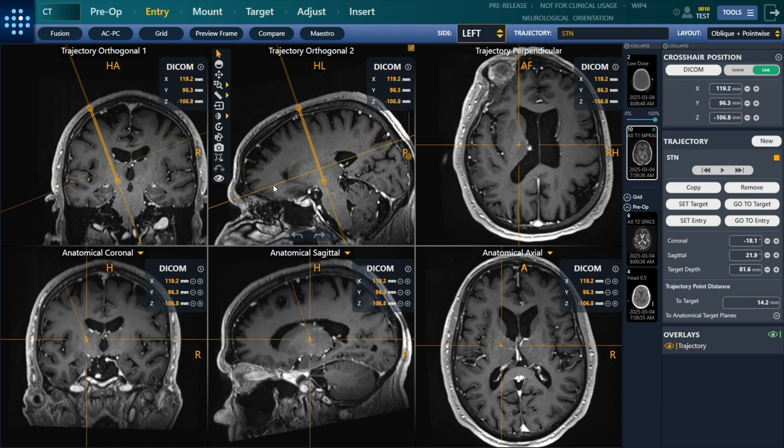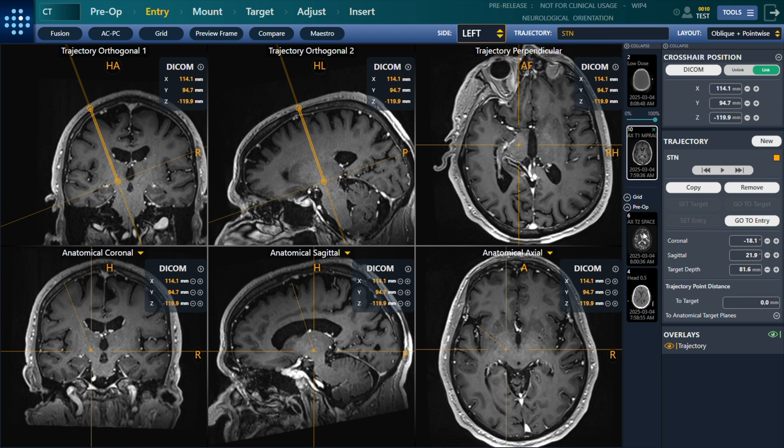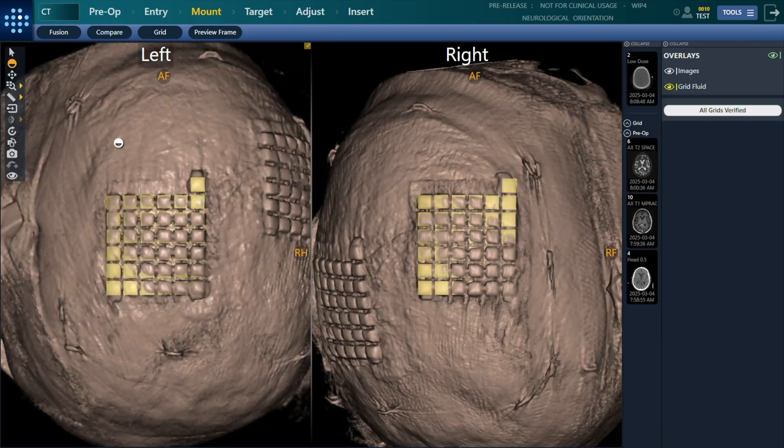The ClearPoint navigation software is purpose-built from the ground up to support image-guided stereotactic procedures. These procedures include biopsies, catheter and electrode insertion, including deep brain stimulation lead placements with the patient either asleep or awake.